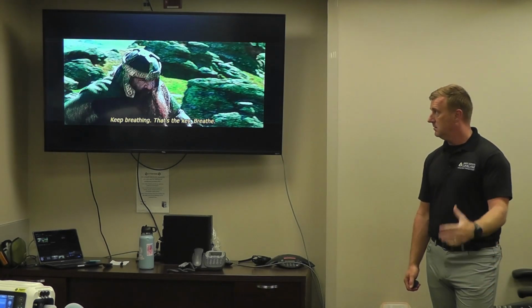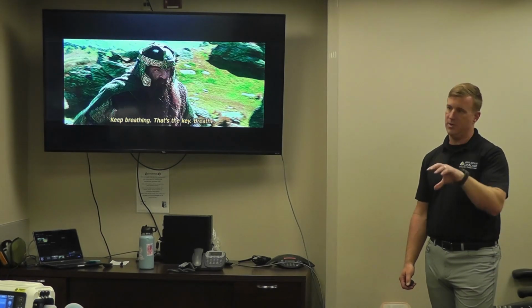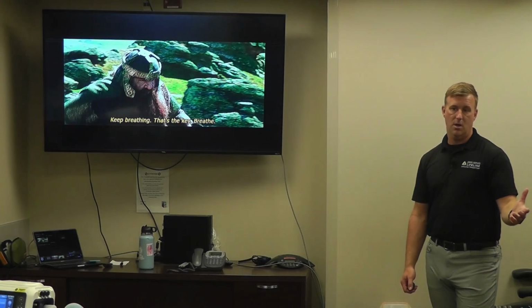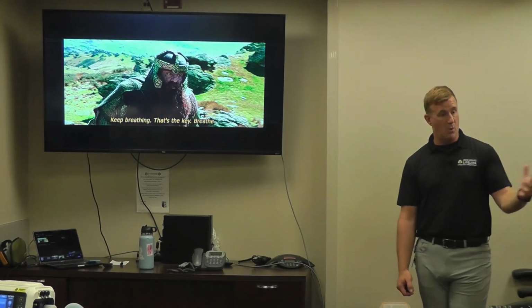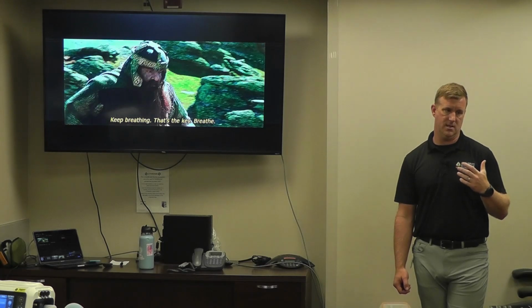Let's say he's in an ED somewhere, like at Howard County's ED, and he just keeps ripping off the non-rebreather or simple mask. What's our next step for this guy? CPAP, right? So CPAP is a version of something called non-invasive positive pressure ventilation, right? You guys use CPAP 911, pre-hospitally, because it's one pressure and it's pneumatically driven, and we'll talk about that in a second.